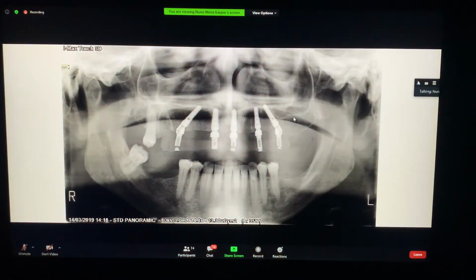So again, with this kind of implant, you can choose on soft bone to have a normal thread design or a wider thread design, like here. You may do bicorticalization or not, because you will achieve a good primary stability because of the implant design, and not only because of this.